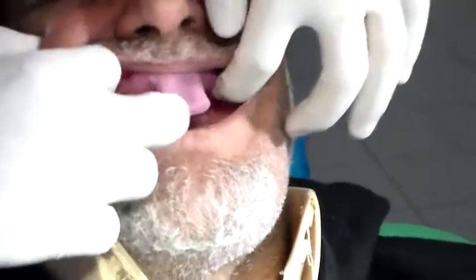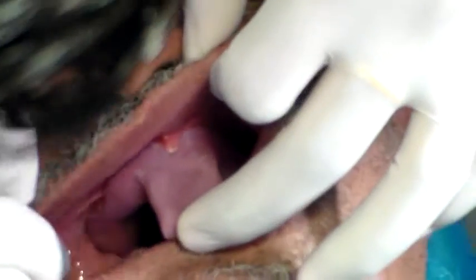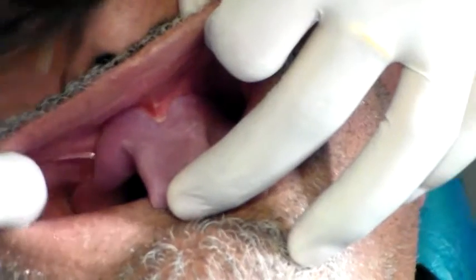I have a rounded tray now — place it in. I can see my phrenums are open, I can see my labial phrenum is open, and it relaxes. When it's stretched up it's difficult, but when it relaxes you see the spaces are located. You need to have a slightly over-reduced in this region — we'll correct that with green stick.